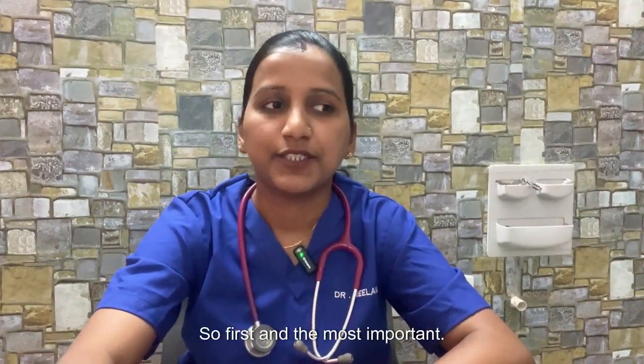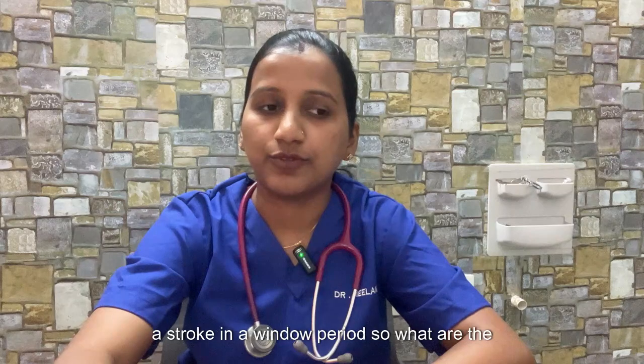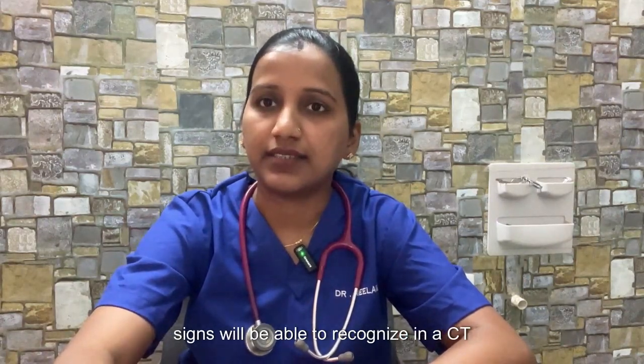Today I have come up with the important CT signs to be able to recognize while working in an emergency room. So first and the most important common presentation to the emergency room is a stroke in a window period. So what are the signs we'll be able to recognize in a CT scan?